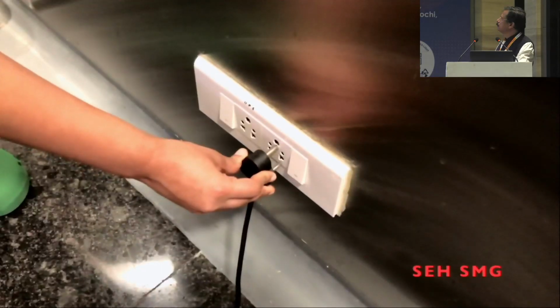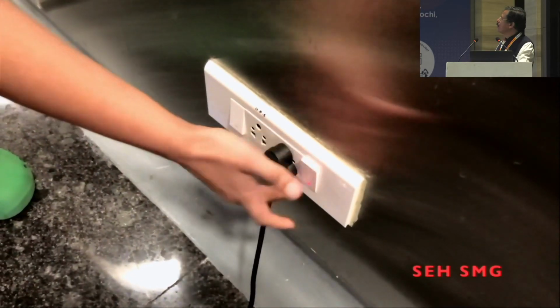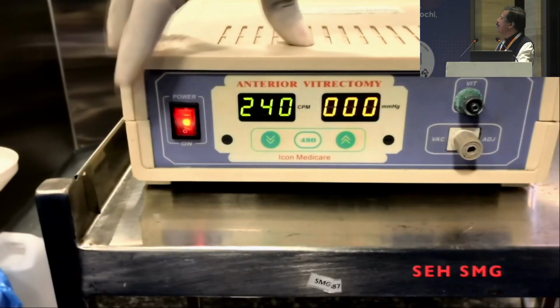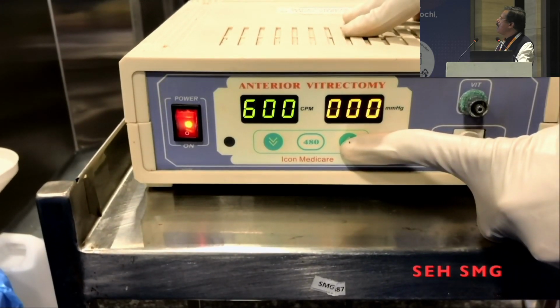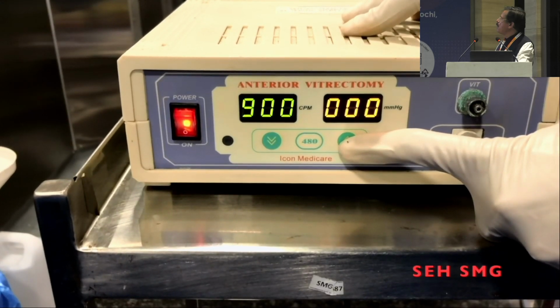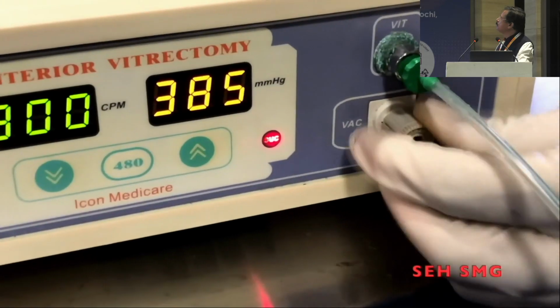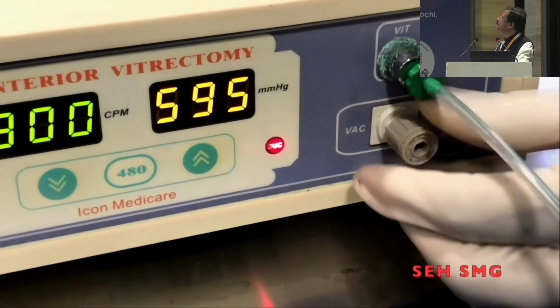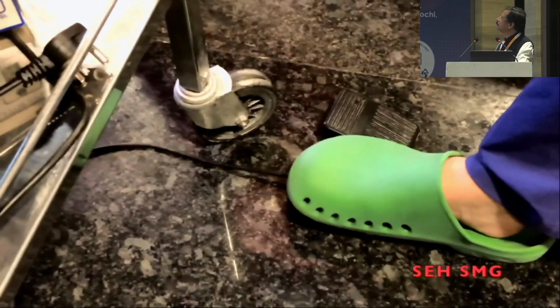The right side of the foot switch is for cutting and aspiration, the left side is for only aspiration. Now it is connected to the electricity and switched on, and the front panel switch is also on. Now we can adjust the cutting rate. It can go up to 900 cuts per minute. And we also can adjust the vacuum by pressing on the foot pedal and rotating the knob. In this machine we can set up to 650 vacuum.